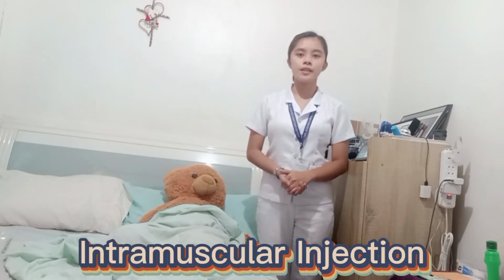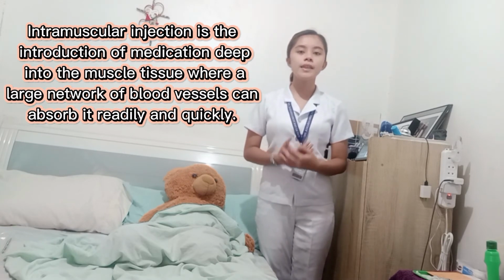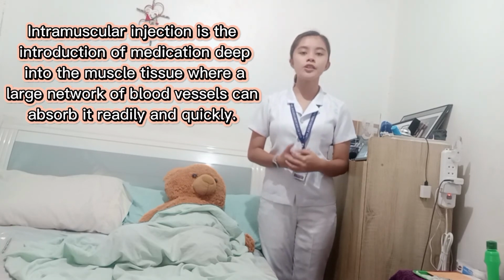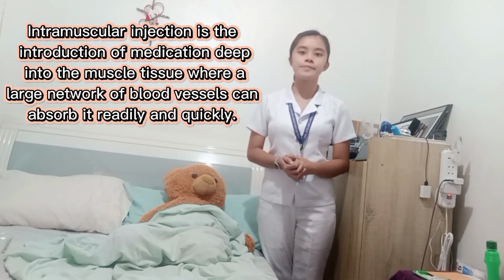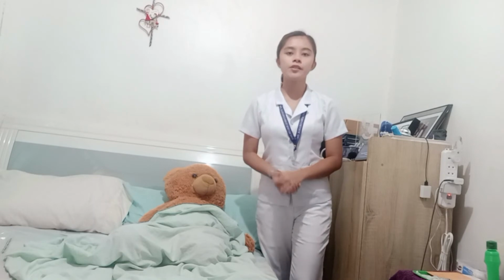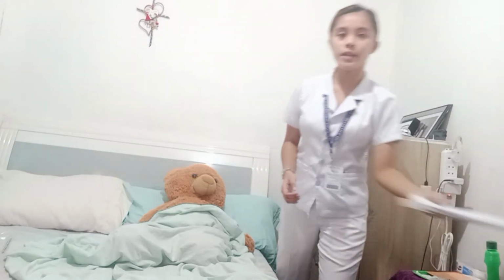So now I will perform the intramuscular injection. Intramuscular injection is the introduction of medication deep into the muscle tissue, where a large network of blood vessels can absorb it readily and quickly. So now I will administer the medication. First thing to do is to check the doctor's order on the patient's chart because it is more reliable than the medication ticket.